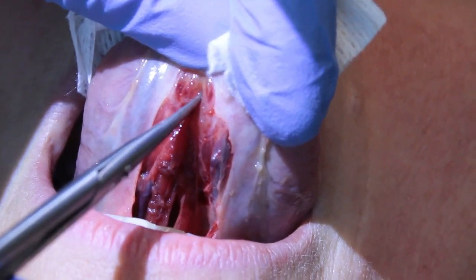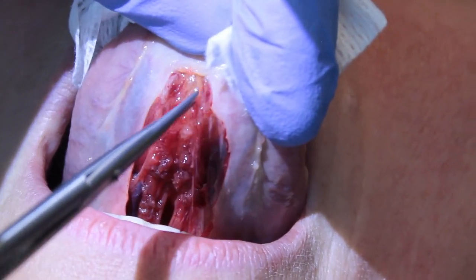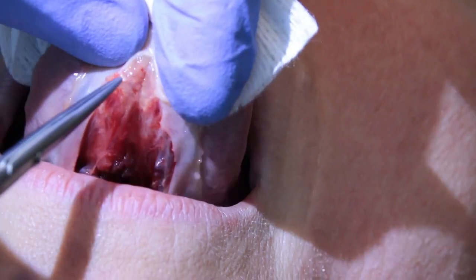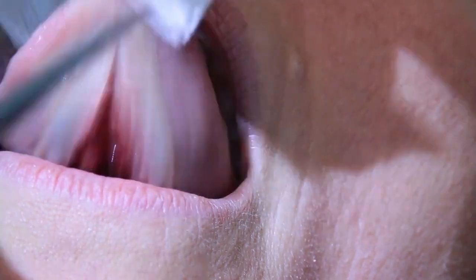See these fibers here? You hear that pop? Yeah — pop. Are you feeling this? No. Lift up. That was it.